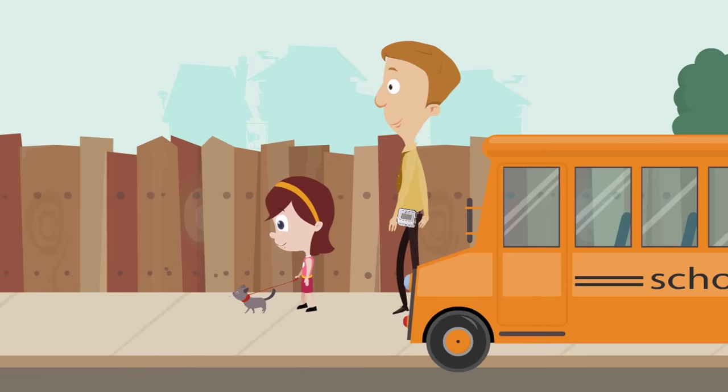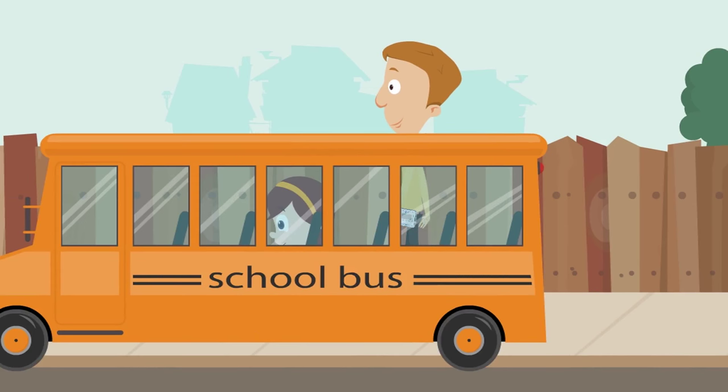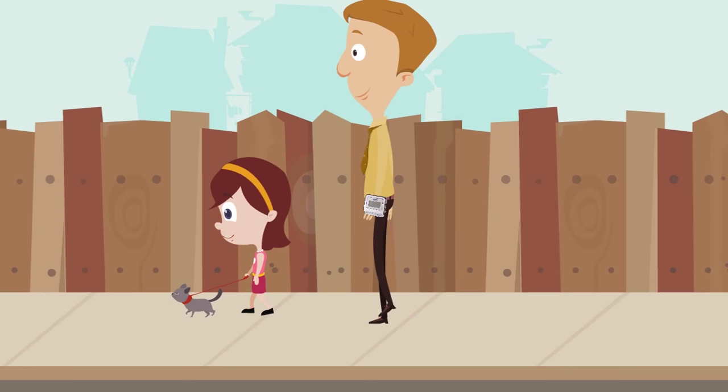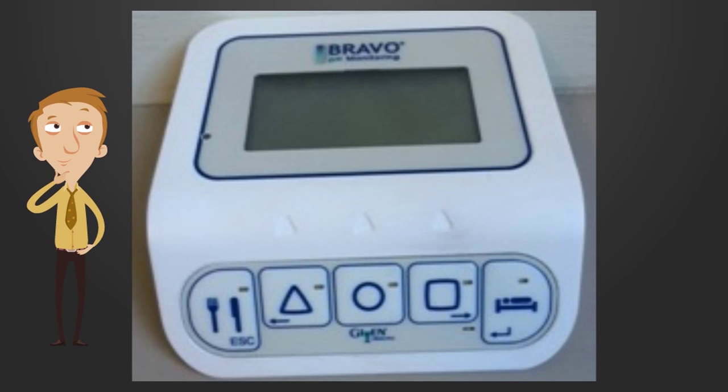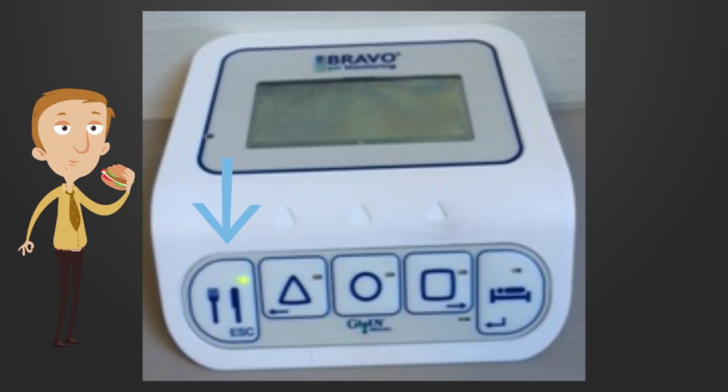In addition to the diary, use the receiver to record your eating habits, symptoms, and rest periods. Wear the recording device on your waistband as you go about your day. The device is very easy to use. Press the meal button once at the start of a meal — a green light will appear. At the end of your meal, press it again and the light will disappear.